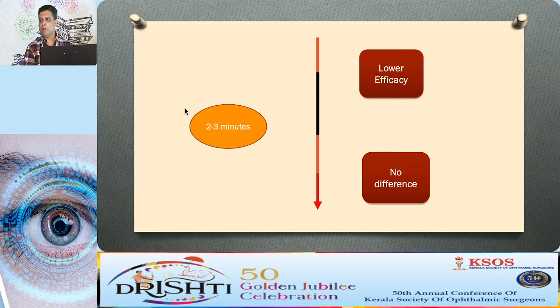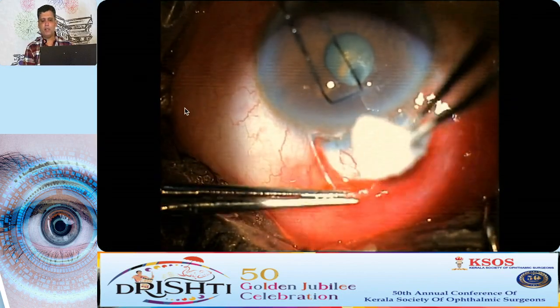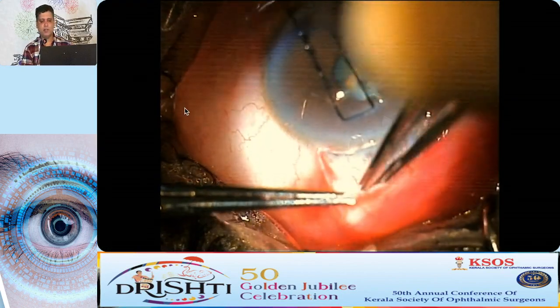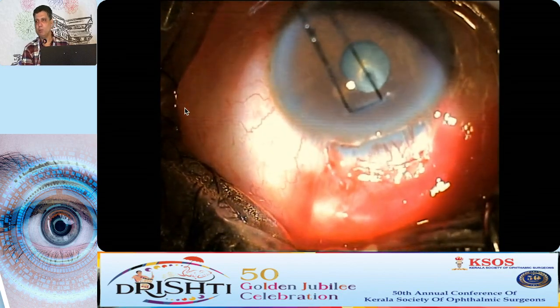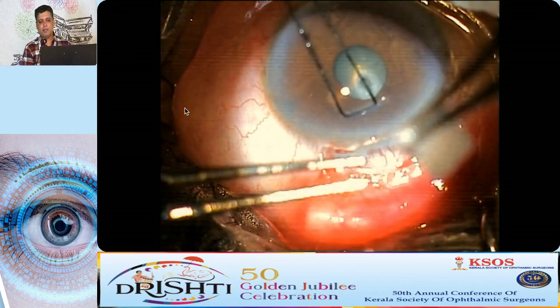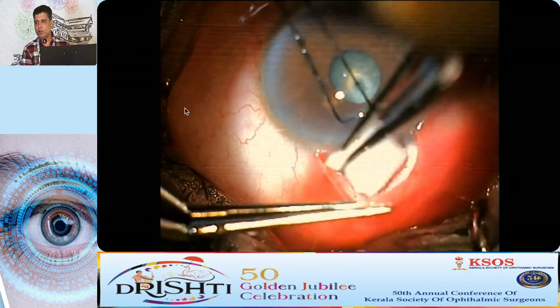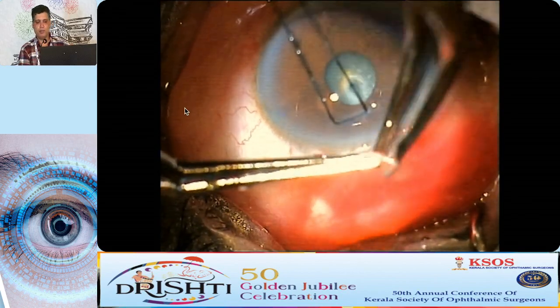More things about mitomycin will be discussed by subsequent speakers. There are two ways you can use mitomycin. Either you can use sponges. If you are using sponges, it's best to use maximum 2 or maybe 3 large sponges rather than multiple small sponges. These sponges can be placed posterior to the area of dissection, making sure that the conjunctival edge does not come into contact with mitomycin.